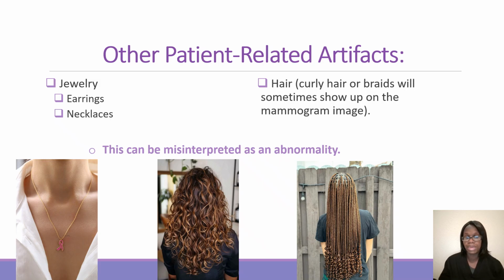You have patients who may have gotten chest x-rays a lot. They normally just go ahead and put their necklace in their mouth. And I always say, no, for this you do not have to. So whenever I see a patient do that, I automatically assume they may have recently had a chest x-ray or get them often for them to do that.